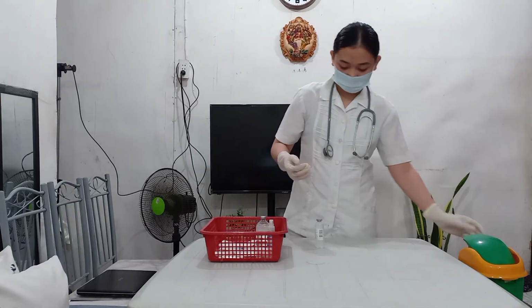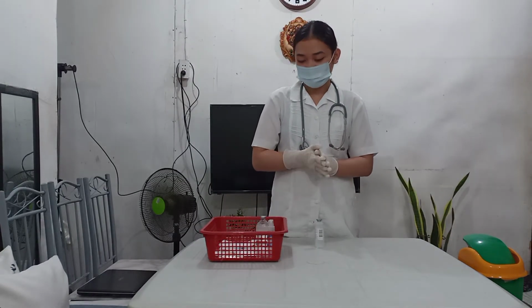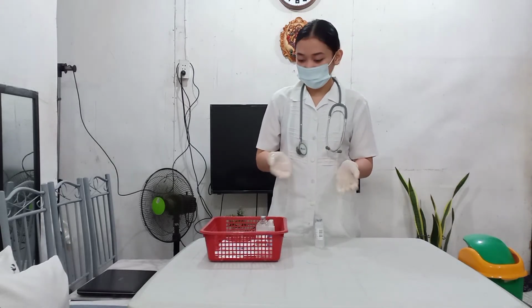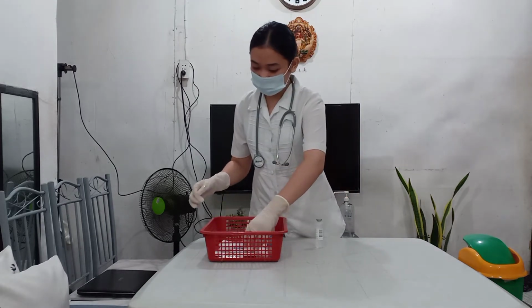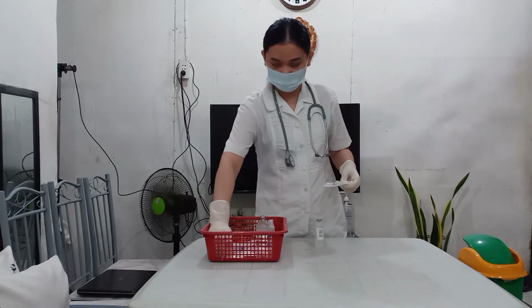Now, we will let it dry for a couple of minutes, and then while waiting, we are going to place the filter needle in the syringe.